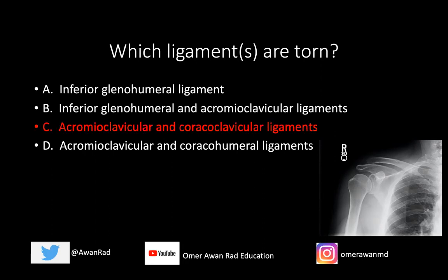This is a grade three acromioclavicular joint injury with tearing of the acromioclavicular and coracoclavicular ligaments. In a busy ED, when you're looking at the shoulder, it's tempting to note that the glenohumeral joint is intact — no fracture, no dislocation — and move on. But this is a very serious injury, and if you're going fast, you may miss it.